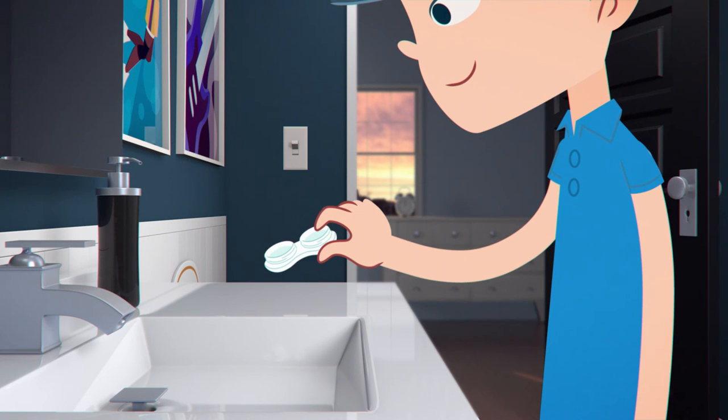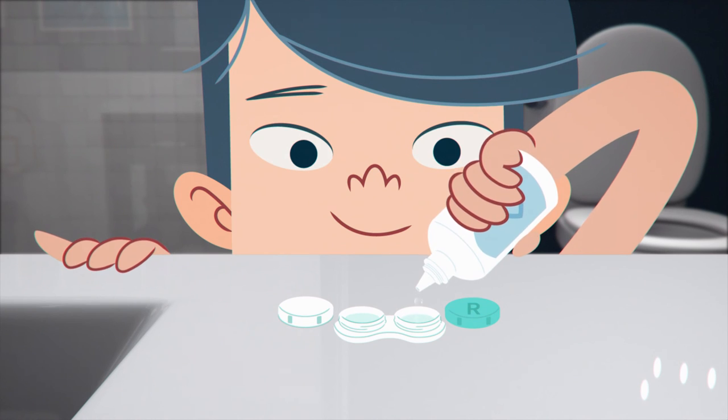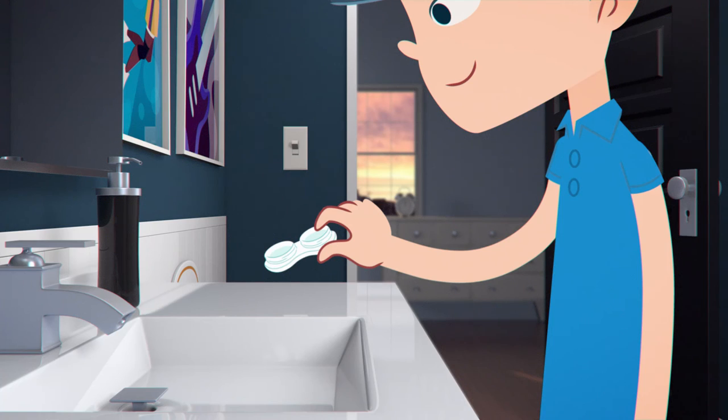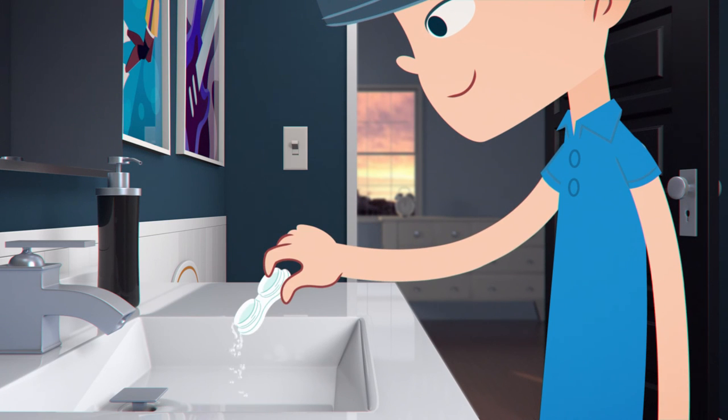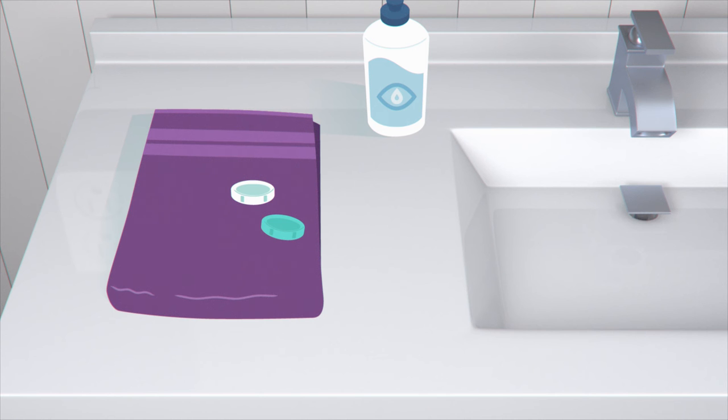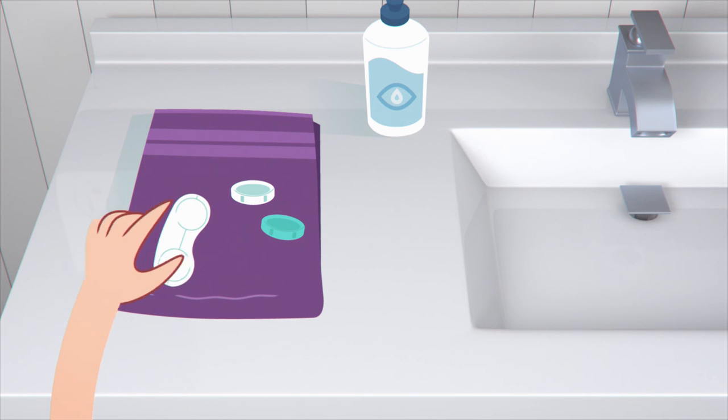Now squeeze a little solution into each cup and gently rub your finger around inside. Discard this solution and rinse with fresh solution one last time. Leave your case out, upside down with the caps off, to air dry throughout the day. This way, you'll have a clean dry case to put your lenses back into tonight.